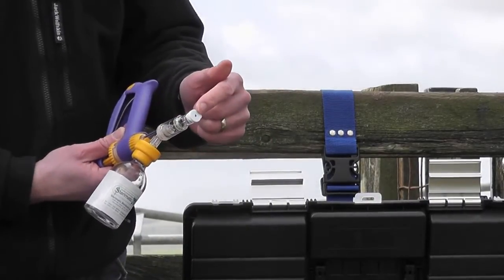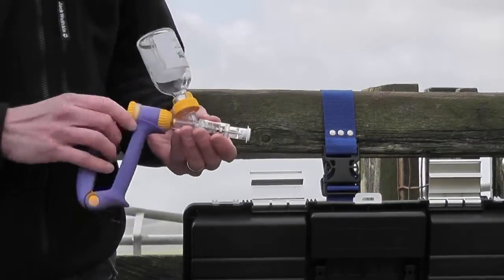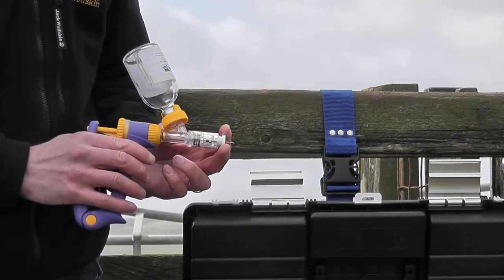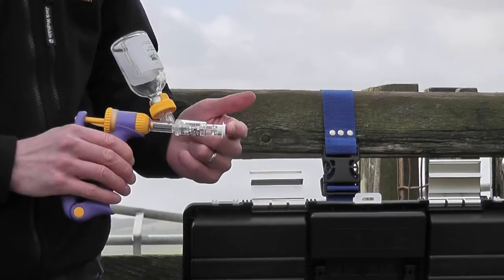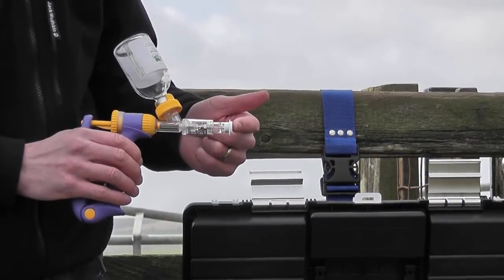Once the system's been fitted, just remove the twist tab from the Steri-Cap and then you can inject as normal. When you push the Steri-Cap against the animal the needle passes through, is wiped clean and you can deliver the dose as normal. And then as you remove the needle from the animal it passes back through the Steri-Cap and is clean for a second time.